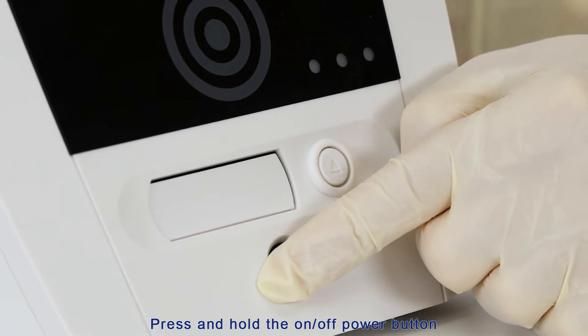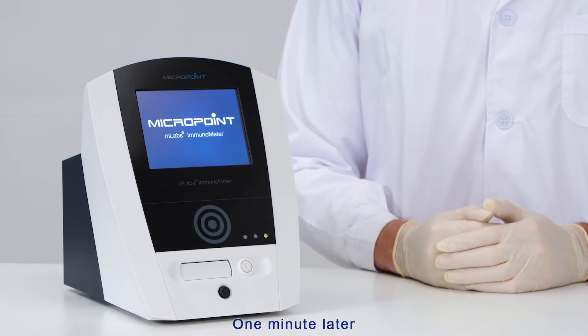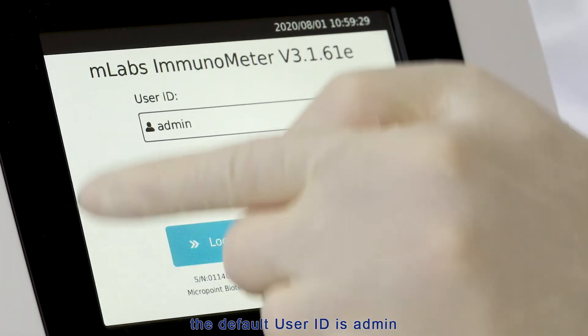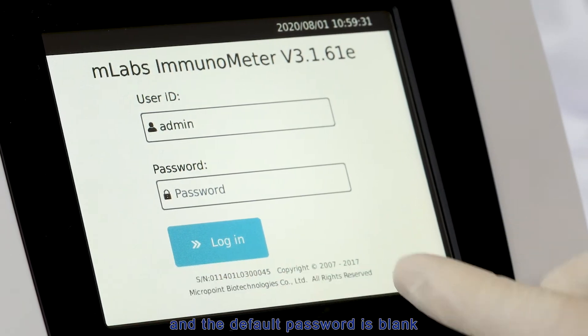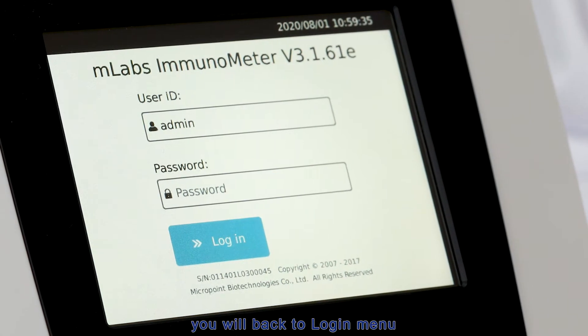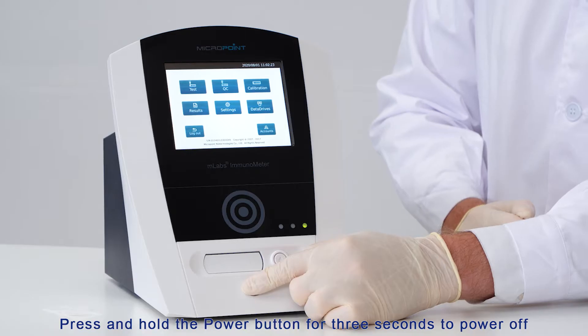Press and hold the on/off power button until the green power light turns on. One minute later, you will see the login menu. The default user ID is admin and the default password is blank. If you want to exit the system or change user, tap logout to return to the login menu. Press and hold the power button for three seconds to power off.